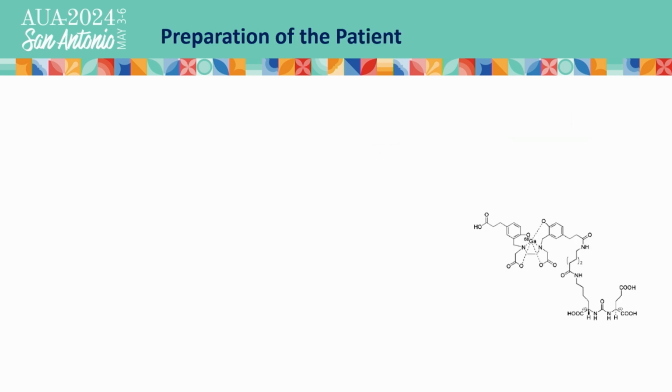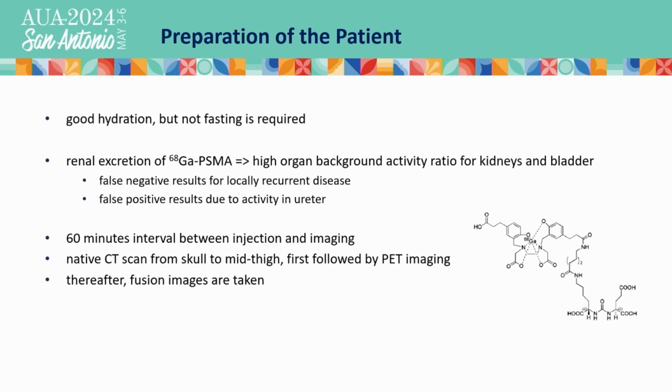When you have a patient who might be scheduled for a PSMA PET CT scan, there are only very few things you should remember, or at least you should advise your patient to. At least he needs a good hydration, because the gallium PSMA is excreted by the kidneys. He does not need to be fasting, but a good hydration is necessary to give good PSMA PET CT scan results. As you can see, there is a renal excretion of the gallium PSMA, and this has some advantages but also some disadvantages.